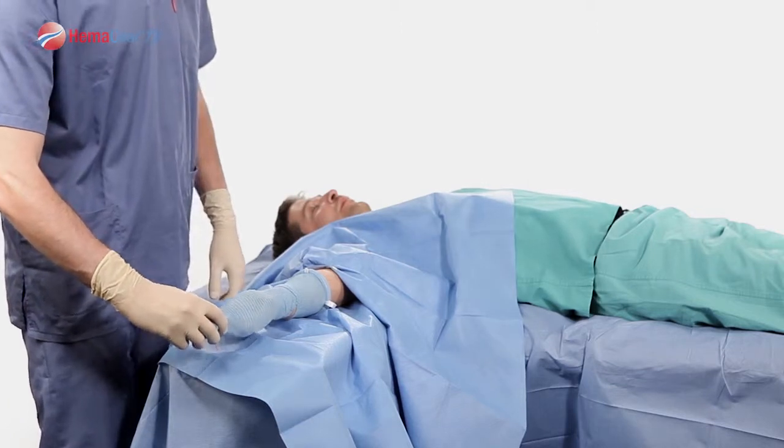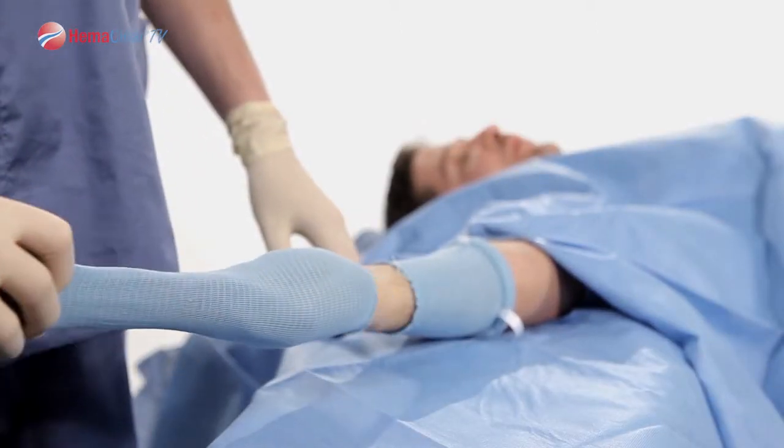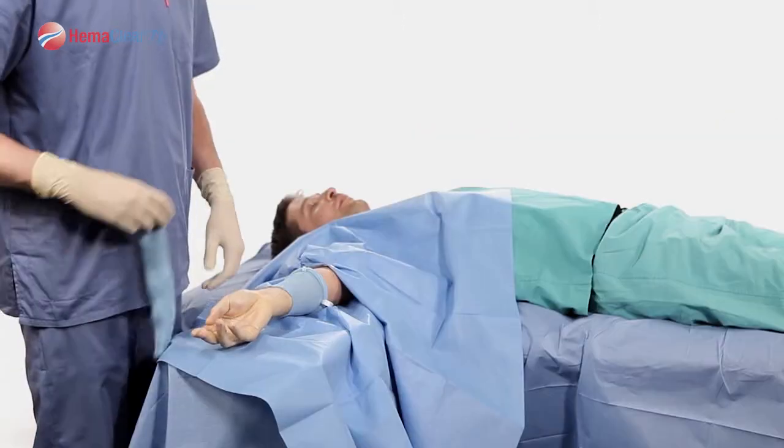To start your procedure, remove the Model F cup, exposing your surgical area. You are now ready to begin your procedure.